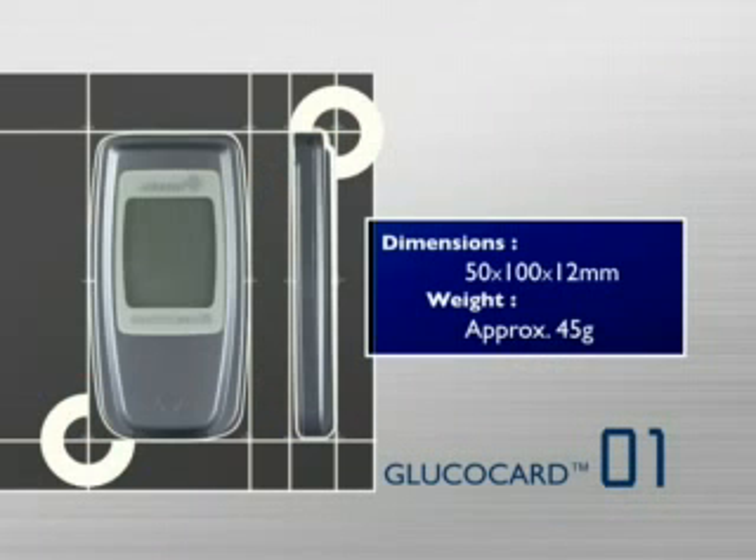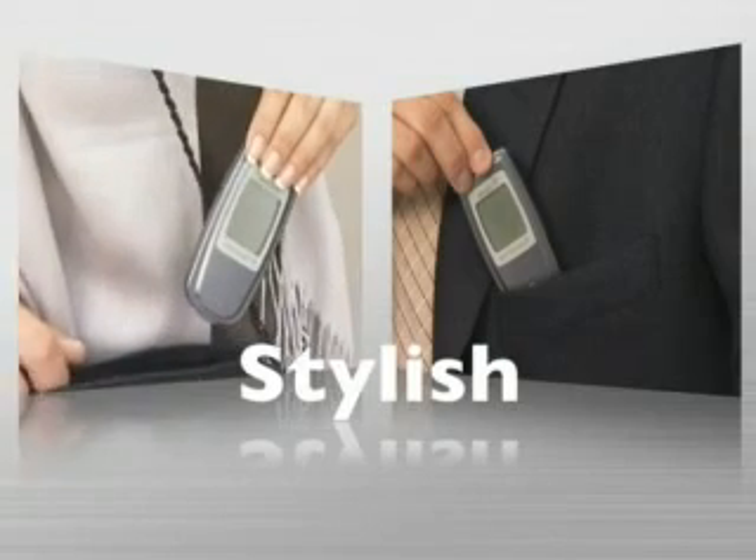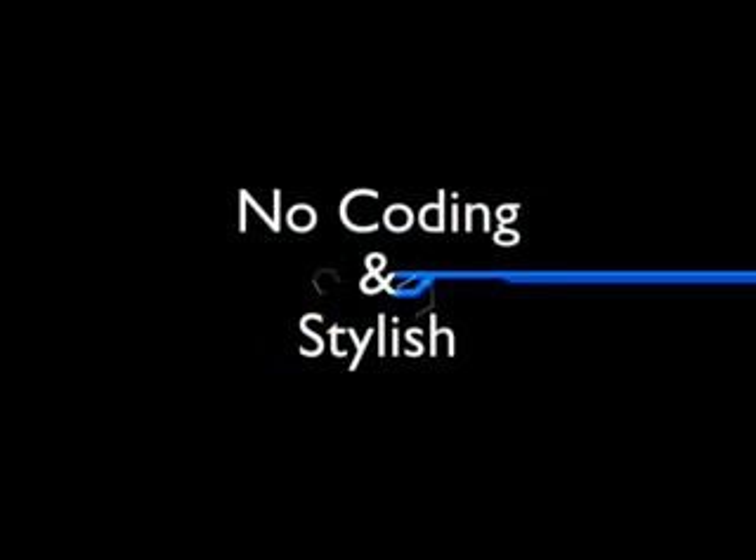Exceptionally slim and lightweight. It easily fits into a suit pocket or a handbag. No coding, and it's stylish.